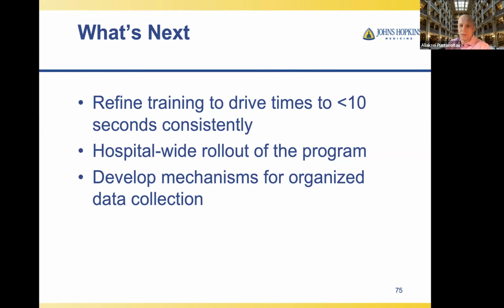We've been talking about it for many years, but now we are starting to have real pathways to do that, and to organize data collection to actually show that we're not harming the patient by prolonging no-flow intervals, because our own defibrillator pads can collect that information, and we can see it on the back end.